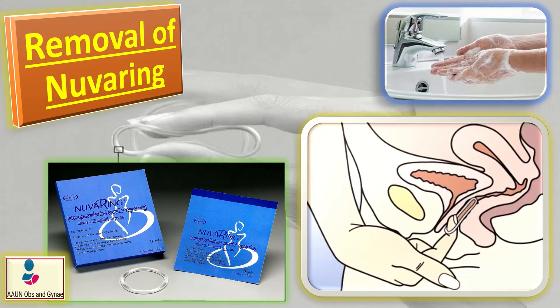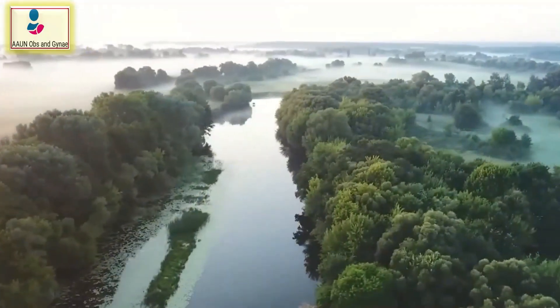Place the used NuvaRing in the foil pouch and throw it away in your household trash.